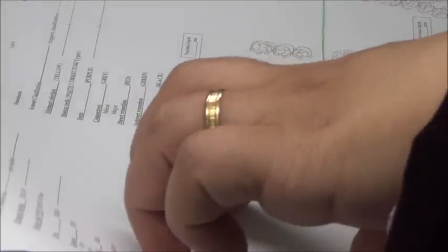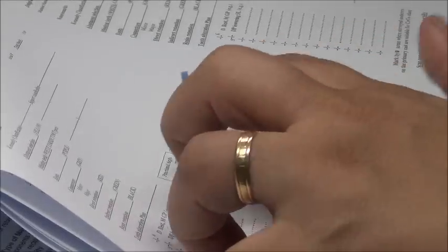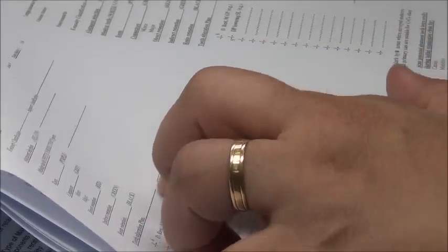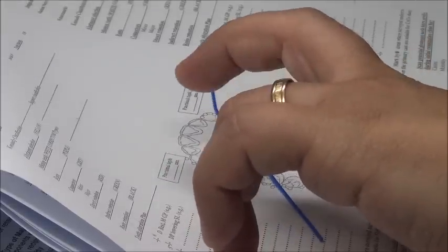Here we have 4 rests on each abutment. So these are stable, there are no rotations, because if these 2 rests are rotating around this fulcrum line, this rest will prevent it, and this rest will prevent it. This is the most stable design.